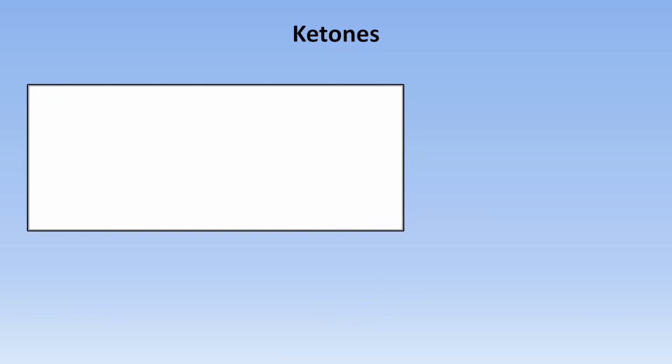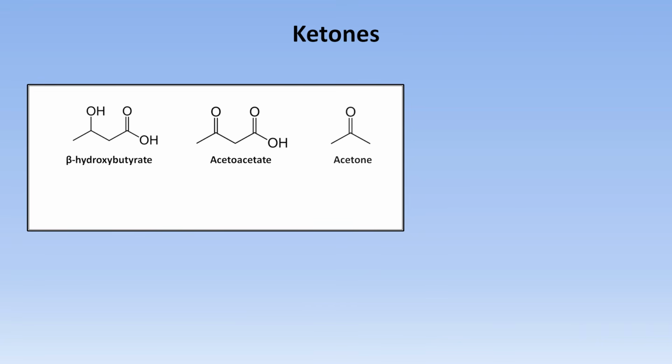Now we move on to a few remaining tests on the dipstick that are less diagnostically helpful and which some hospital labs don't even routinely report. First among these are ketones, more specifically ketone bodies. To remind you, there are three ketone bodies: beta-hydroxybutyrate, acetoacetate, and acetone.